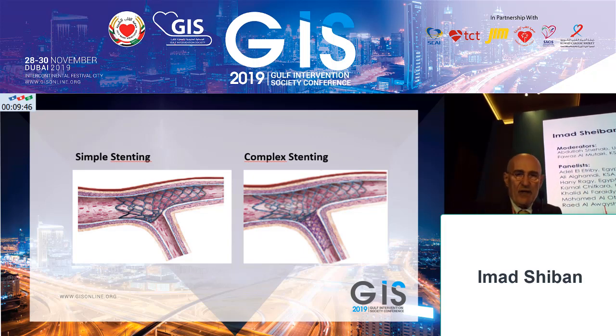I would start just distinguishing about modalities of stenting in bifurcation. I think we agree that simple stenting and complex stenting are different subsets.